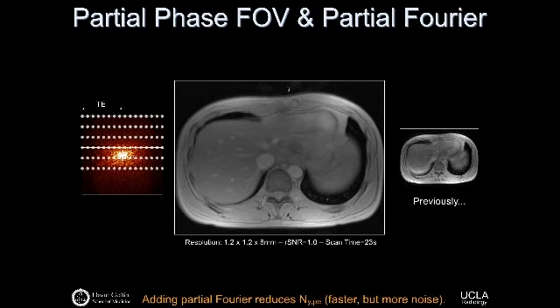And what we didn't talk about yet, but you may have recognized, is that there's some symmetry in K-space. The top of K-space looks a little bit like the bottom of K-space, and the left part looks a little bit like the right part, and it's obviously focused energy in the middle of K-space. Well, it turns out you can skip acquiring entire parts of K-space because there are some symmetries in K-space.